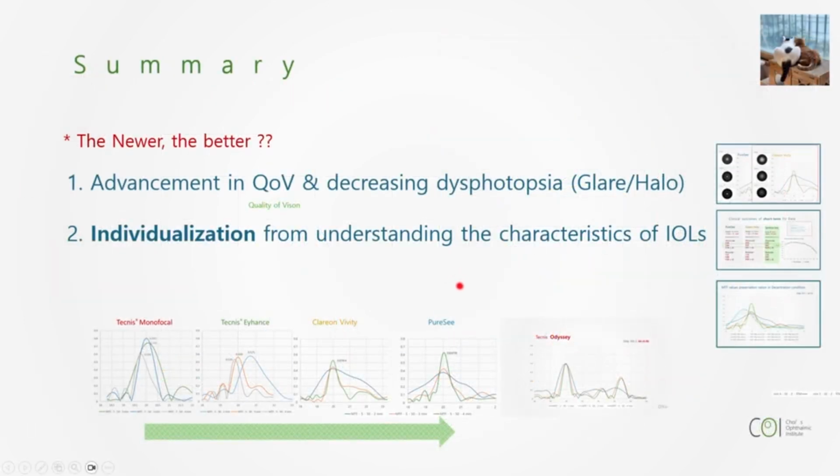In summary, I cannot definitely say that the newer the better, but absolutely there was an advancement in the quality of vision and decreasing dysphotopsia. So it is very important to understand the characteristics of IOLs to individualize your patient.